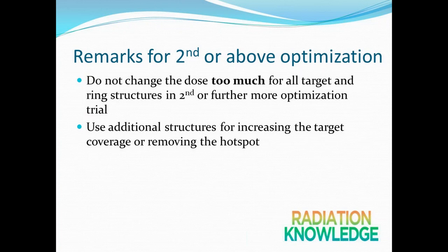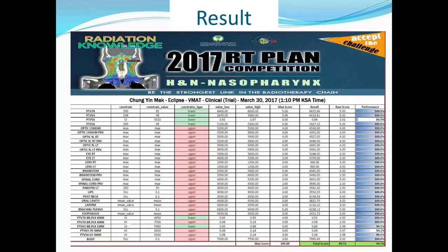For the second optimization, after the first pass, do not change the doses too much for targets and ring structures. You can change OAR priorities slightly as small amendments. Use additional structures to increase target coverage and remove hotspots. Priorities for these additional structures should be around 80 to 100. You can then see my final results for this clinical plan.